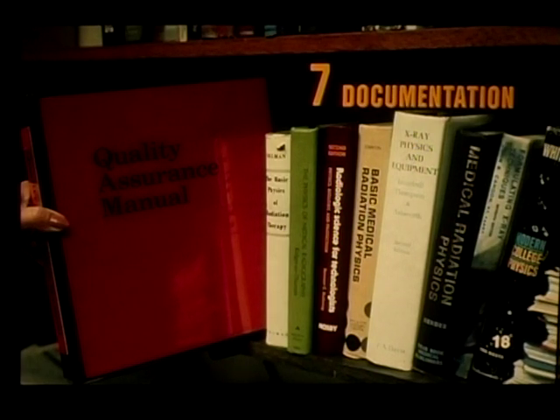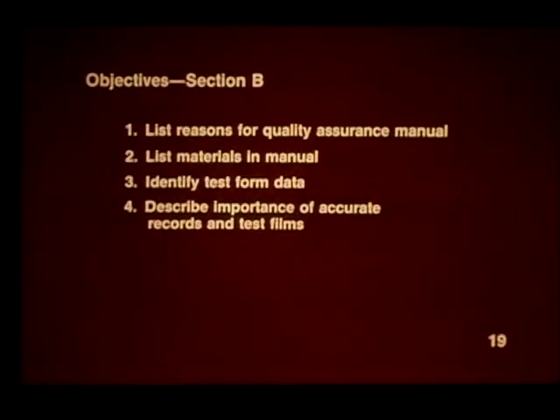Number 18. Once the quality assurance program is established, much data on policies, procedures, and test results will be generated. This data must be documented and easily accessible to program participants. Otherwise, it will be difficult to analyze results, correct problems, and implement changes. Step 7 concerns gathering the factual information generated by the quality assurance program and organizing this material into a comprehensive manual.